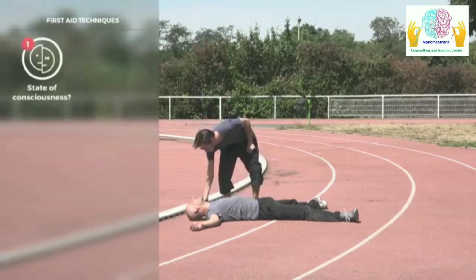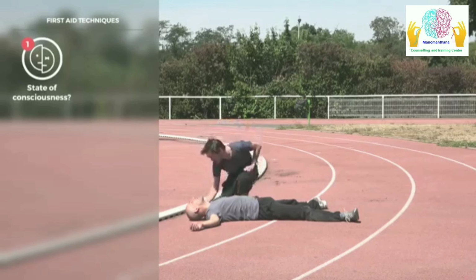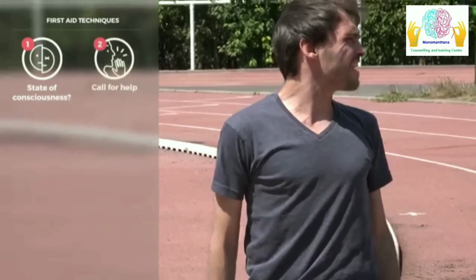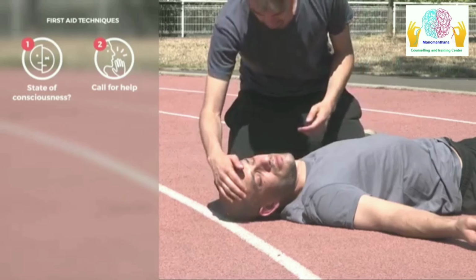If the person does not respond to you when you speak to them, whilst holding their hand and gently shaking their shoulders, call for help if you're alone, and lay them on their back.